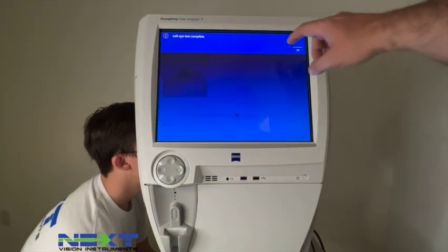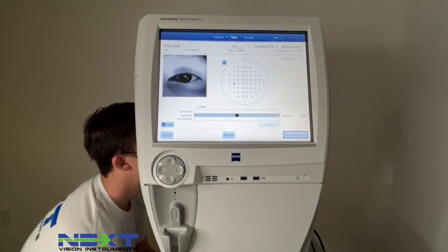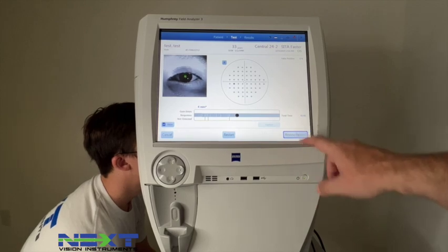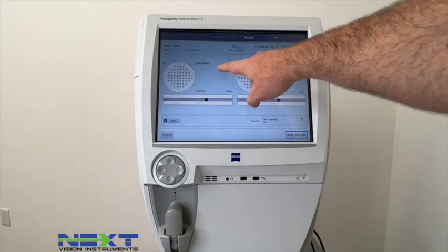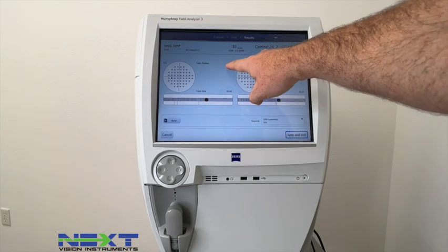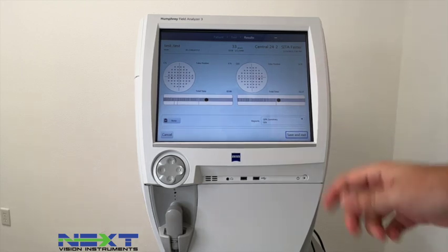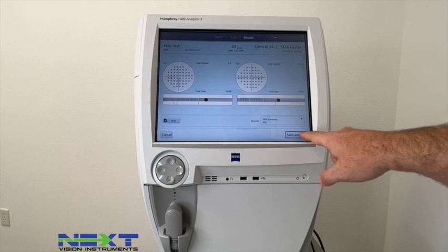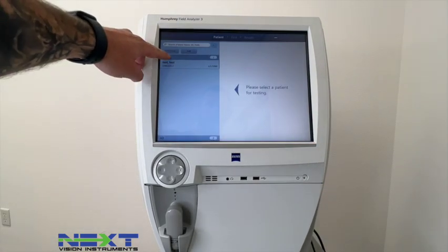It will say Left Eye Test Complete — hit OK. You can either restart or go to Review Results. You can see here that on the left eye there were 0 false positives and 10% on the right eye — still a good test, no need to repeat. Hit Save and Exit.